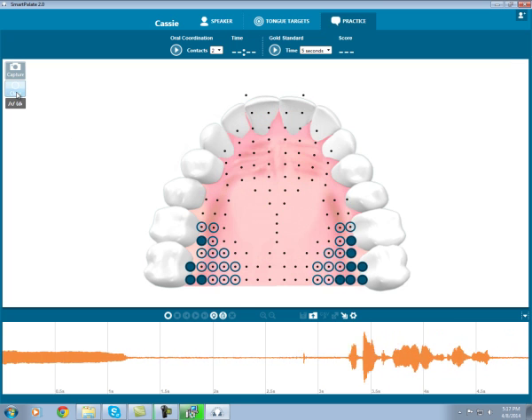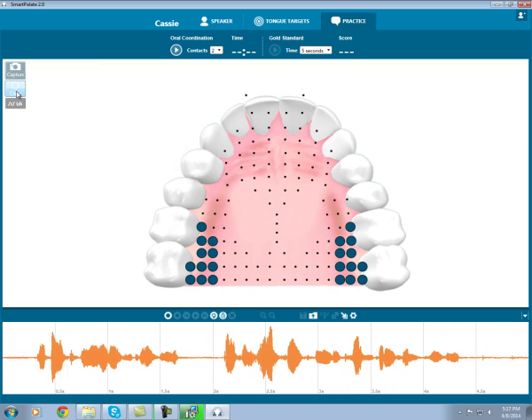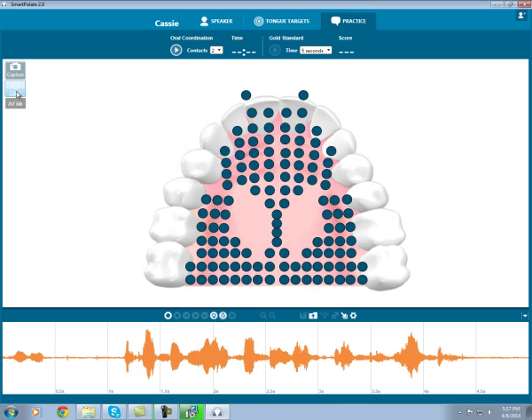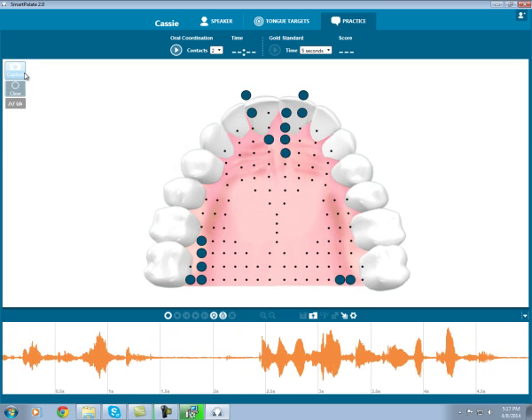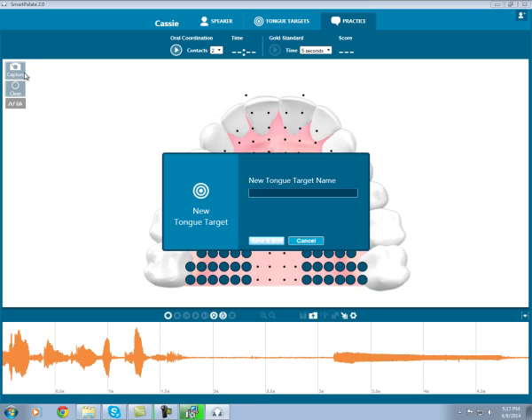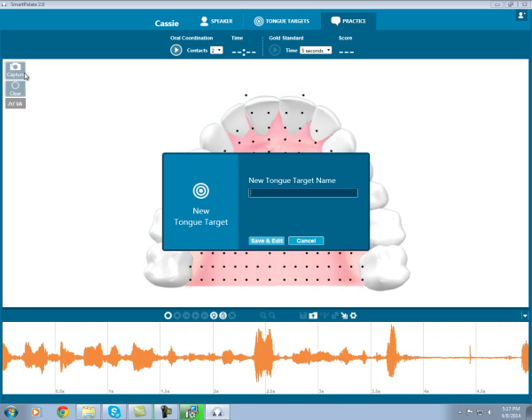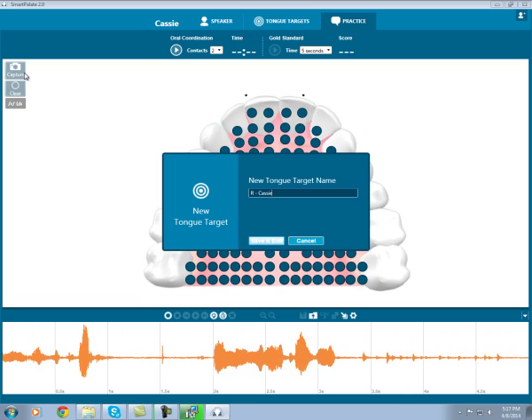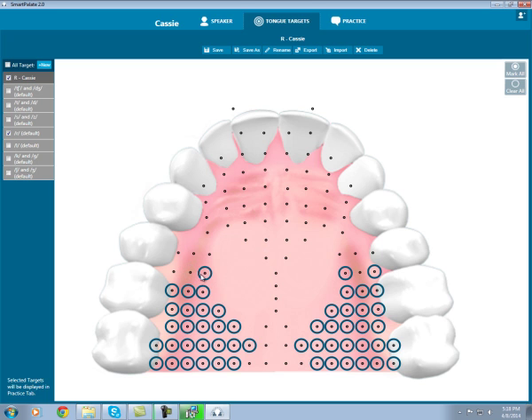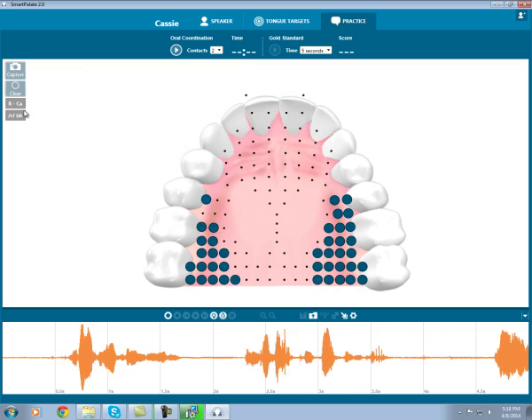If I clear this target, I can also create a custom tongue target that captures my personal best production of the R sound. As I hold the R sound, I will hit capture. This captures any sensor that my tongue was touching at the exact moment I hit the button. I'll name my new target, hit save and edit, and make any changes I see necessary. Because I got a fairly good production of the R sound, I'll only make one or two small adjustments to even things up. Save my changes, and go back to the practice tab. Now I'm able to use my custom R.